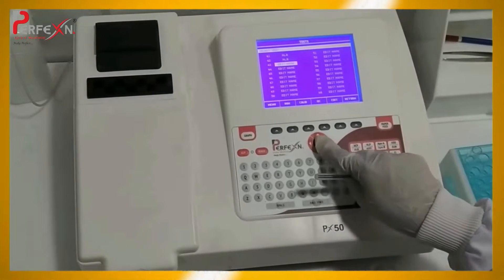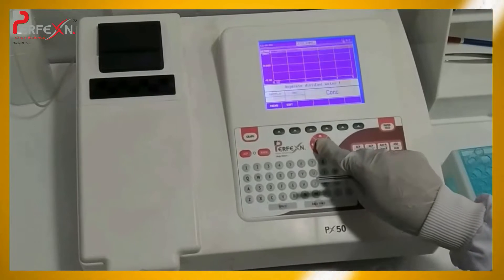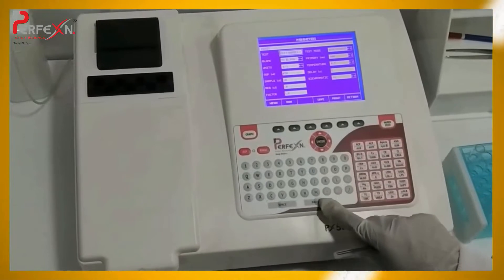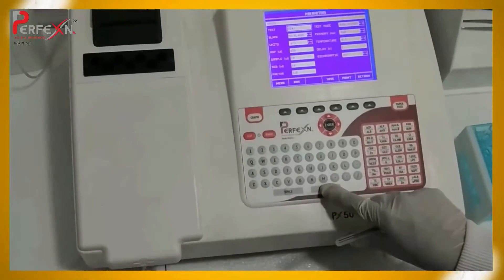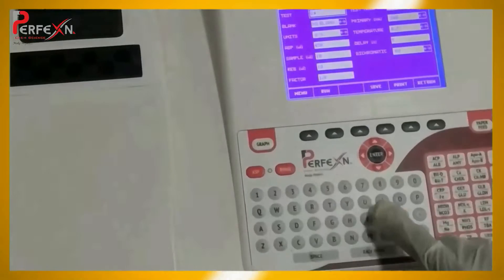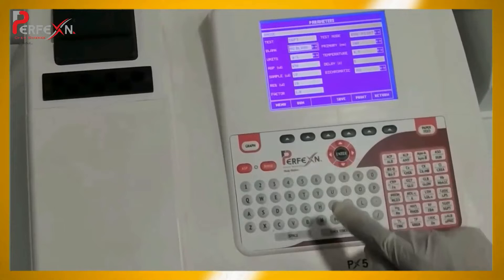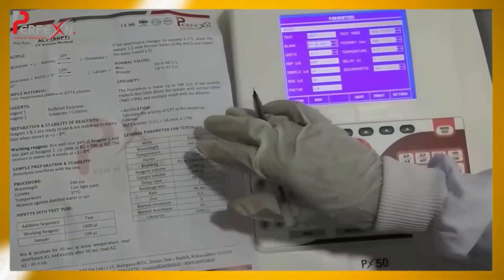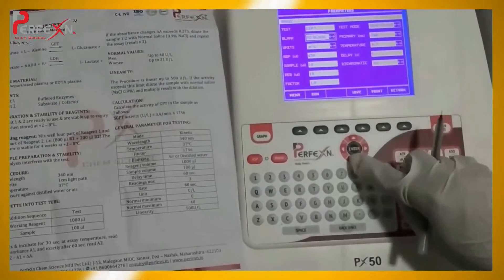Now go to the edit option. Edit the name — you will see the basic option. Go to edit name. As we are performing the SGPT test, we have to enter SGPT as the test name. Now come to the blank setting. As this is the kinetic method, the manufacturer's literature confirms it is a kinetic method, so there is no blank. Enter no blank.